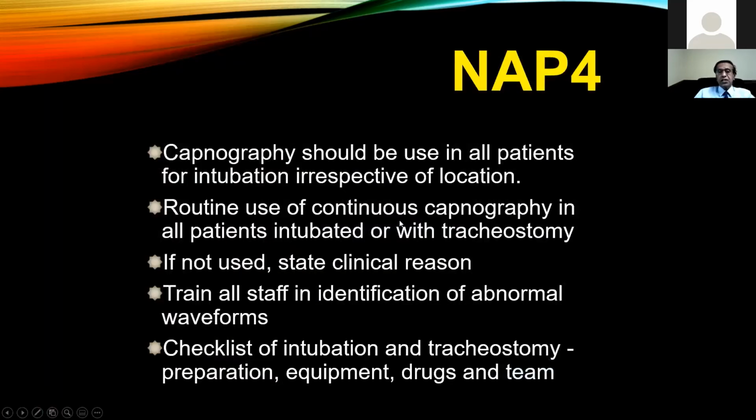So this NAP4 study, what were their final conclusions? Capnography should be used in all patients for intubation irrespective of location. Routine use of continuous capnography in all intubated patients or with tracheostomy. If not used, state clinical reason. Train all staff in identification of abnormal waveforms. As I said, capnography requires a certain amount of understanding for proper interpretation and use in clinical practice.